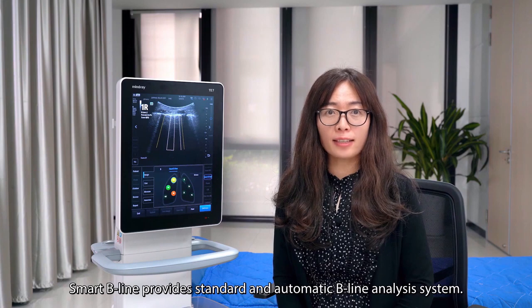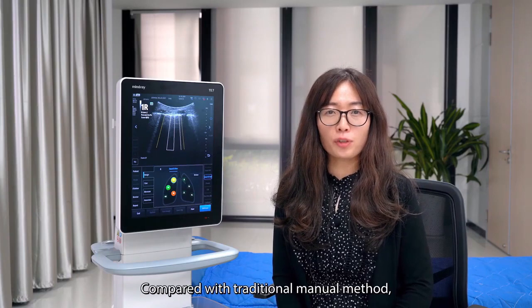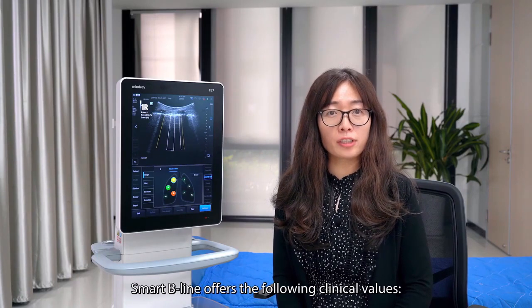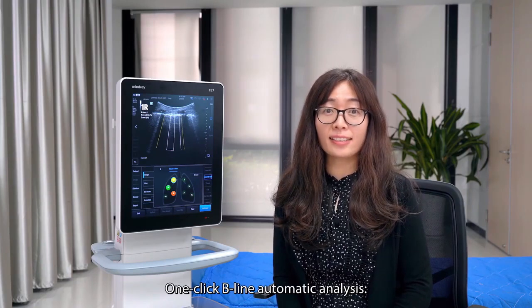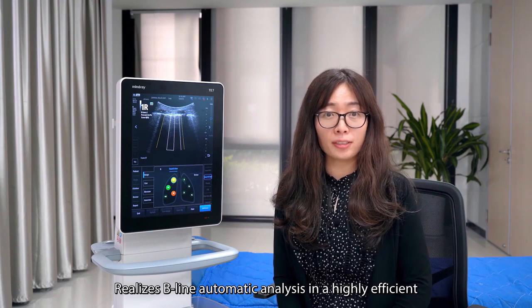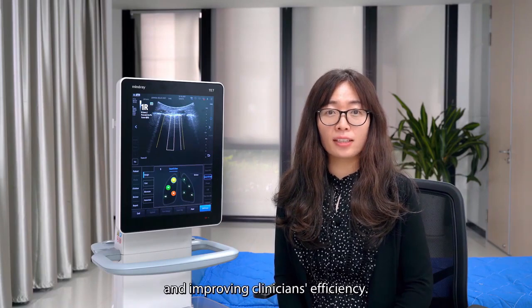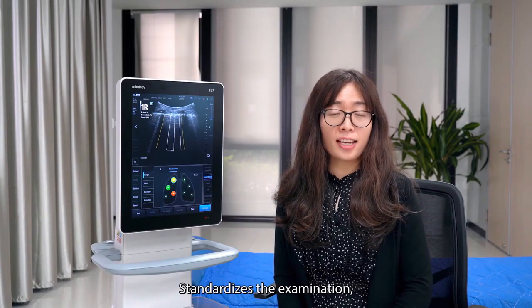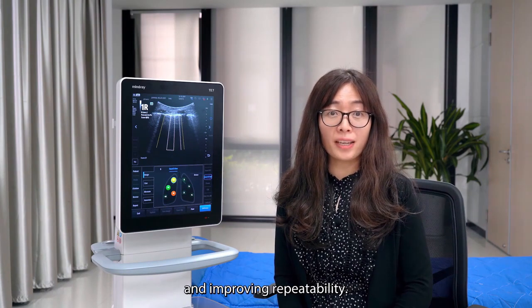Smart B-line provides a standard and automatic B-line analysis system. Compared with the traditional manual method, Smart B-line offers the following clinical values: one-click B-line automatic analysis, realizing B-line automatic analysis in a highly efficient and convenient manner, reducing scanning time and improving clinicians' efficiency, standardizing the examination, reducing the dependency on operators, and improving repeatability.